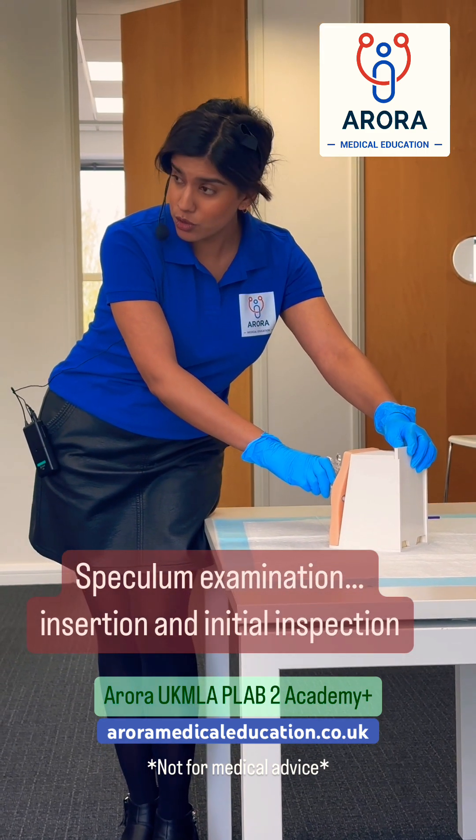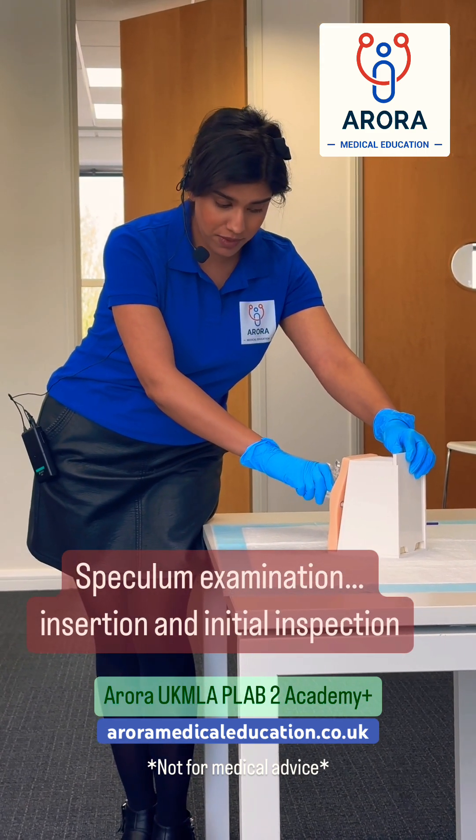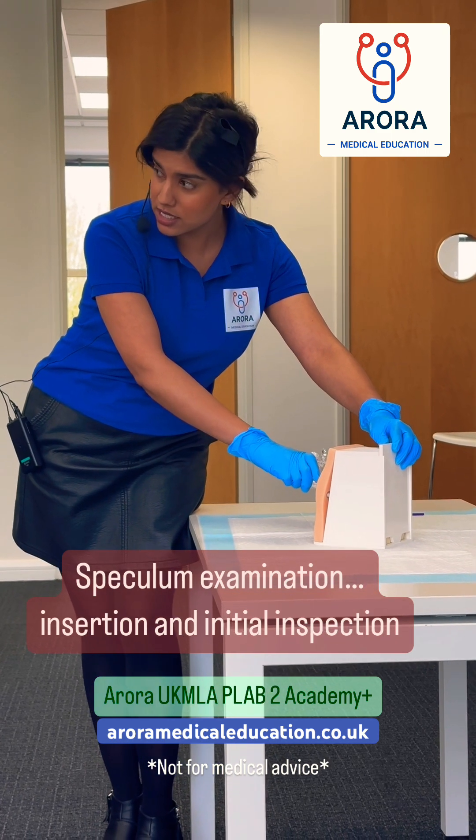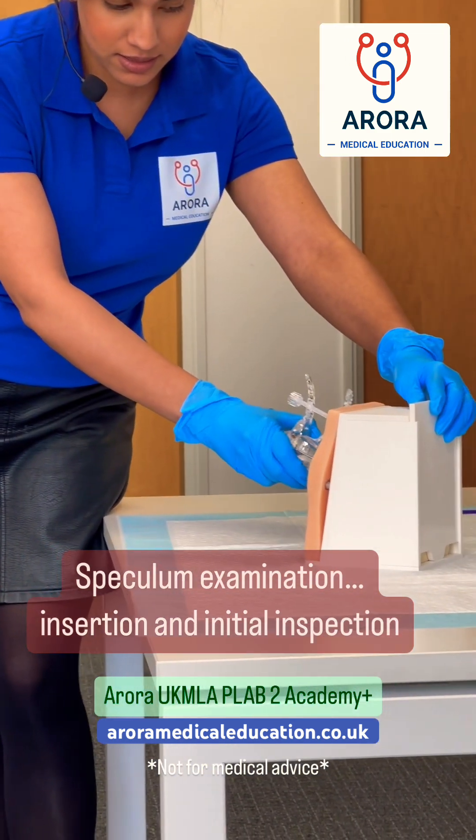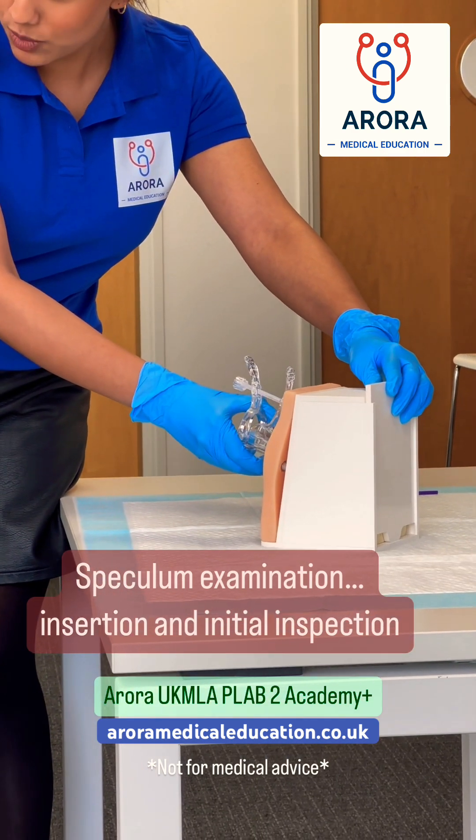Once you've got it all the way in and you can't get it any further, at this point you turn it 90 degrees so the handle and the bolt is facing the ceiling. So it's facing this way.